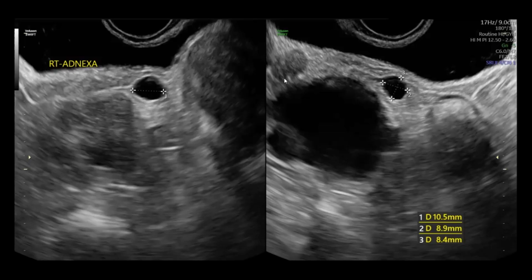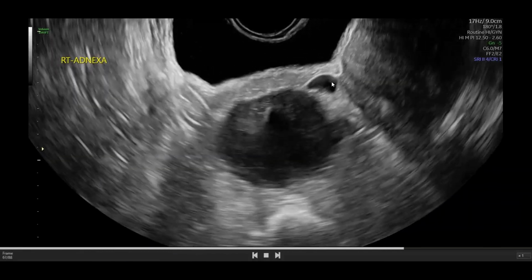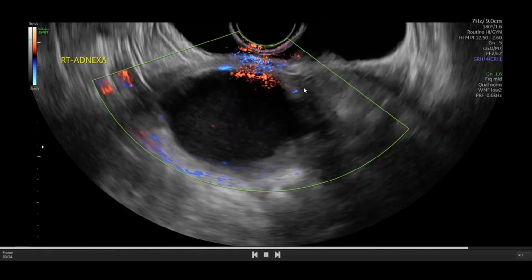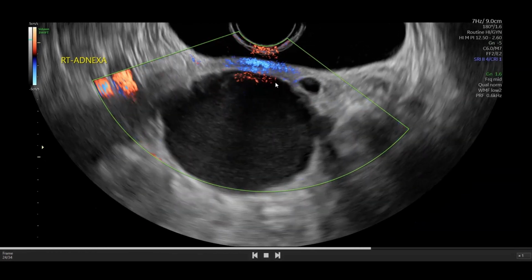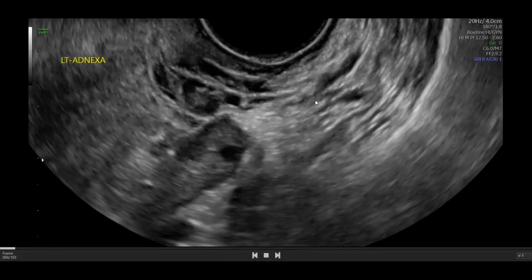And then there's another little baby cystic lesion right next to it. Also, probably unilocular. I think, did we scan through it in this view? There it is, but just the end of it. Just a small little thing there. There it is again. It wasn't part of what we were looking at until our sonographer said, hey, look at this. So most likely those two together make up paratubal cysts.